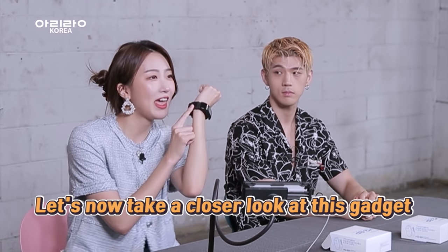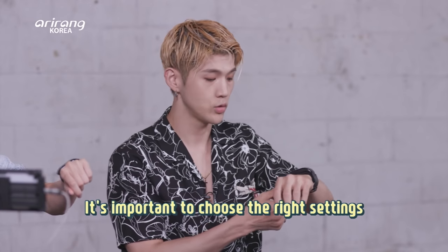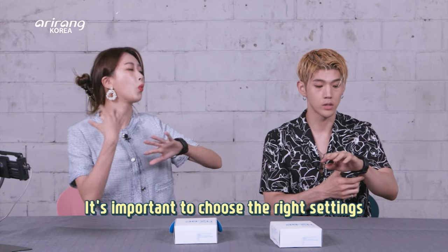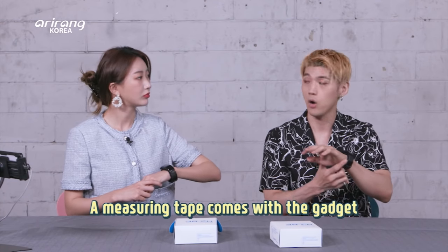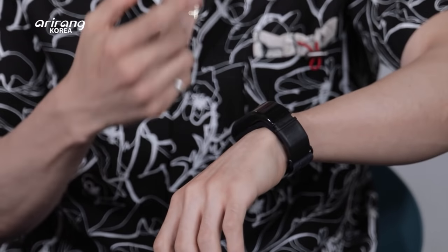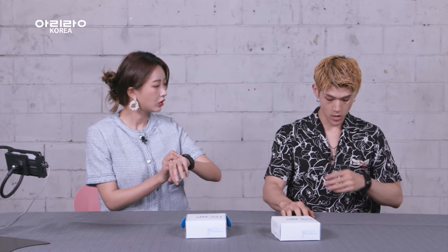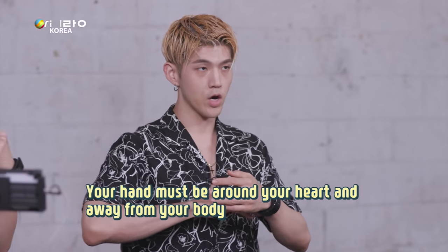Let's take a closer look at this gadget. When you look at it, there's a button. There are certain settings that you have to match to yourself — it adjusts to how thick your wrist is. There's a measuring tape that comes with it. After you do the settings right, you just press this button. But before you press the button, you have to make sure your hand is around where your heart is and slightly off your body — just a little bit. It's very light.